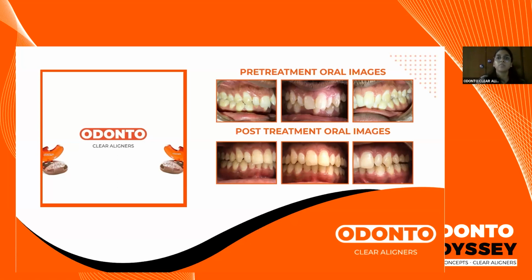And we want to avoid that because we want to give a plan which will help out in unraveling, aligning the teeth, and then having a good occlusion. So that is how it goes about. Which is why this is not one of the cases that you would want to start with. But if you have been practicing with aligners, if you have experience with aligners, with simple cases, then you can always move a step up to moderate category cases and have a good correction with such.